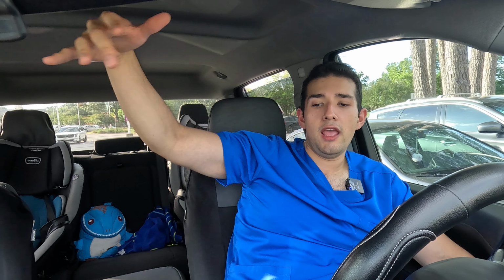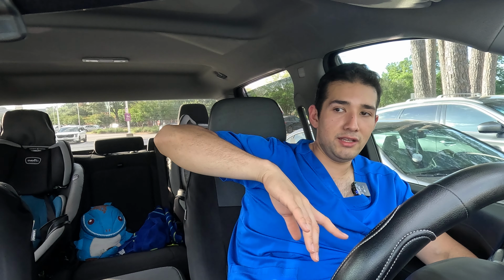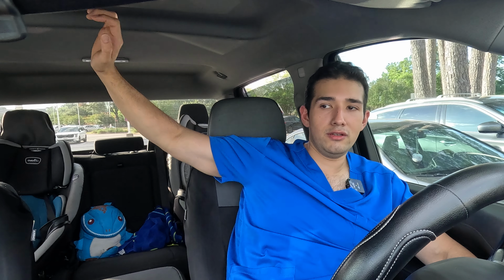Let's see. When you're setting up the table, sometimes if you don't pull it under the X-ray table and you have it still connected to the wall bucky, and you expose, you'll get a blank because you're not exposing the table, you're exposing the wall. So you just swap it out. Sometimes it'll stop you and prevent you from shooting. Other times you shoot it until enough scatter hits the table, then it'll stop. So that's a common one you'll see.